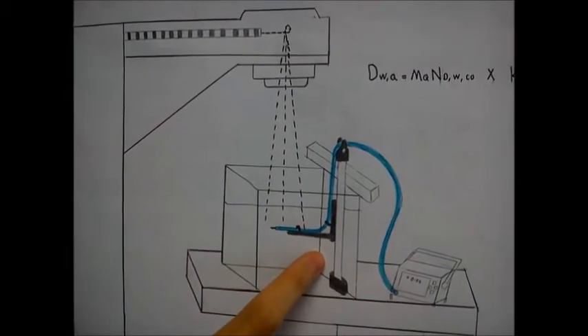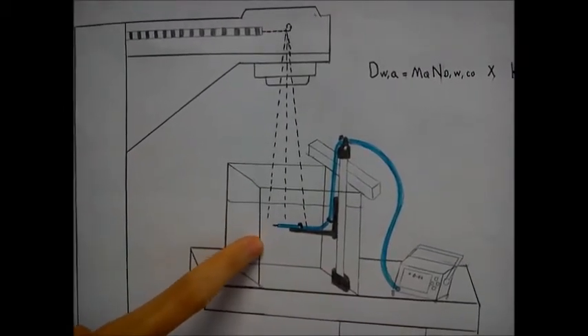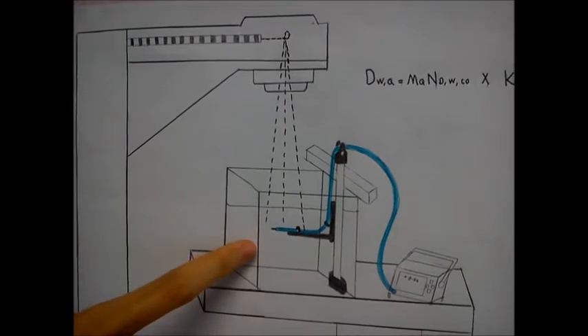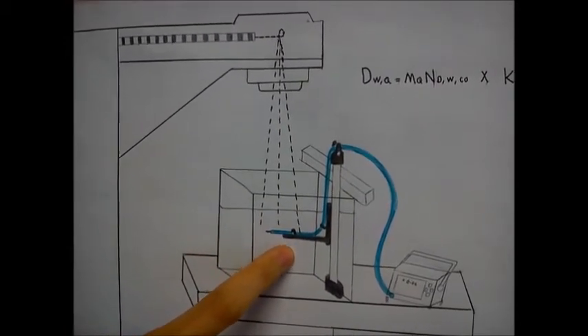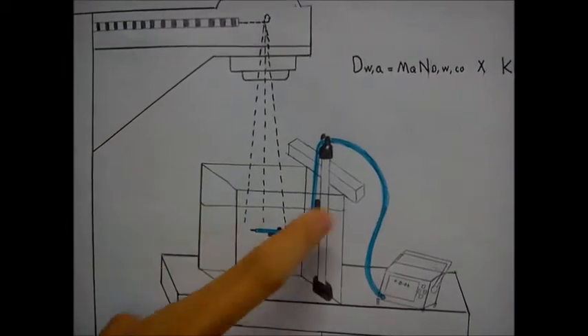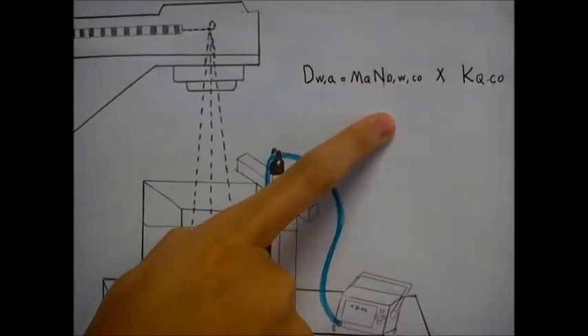Calibration of the megavoltage photon beam is based on a dose-to-water chamber calibration coefficient, which we obtain from a standard laboratory with a chamber irradiated with a cobalt-60 beam at a reference depth in a water phantom. This is the formula for calibration of the photon beam in a water phantom.